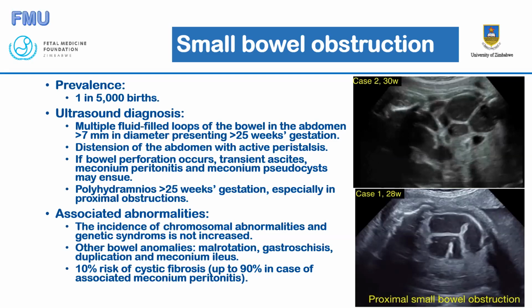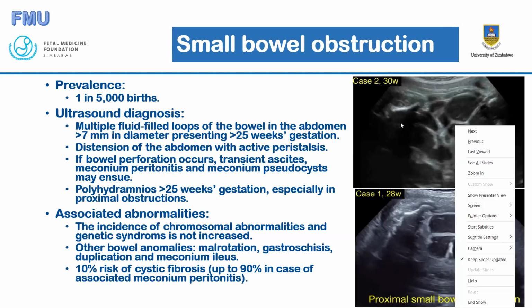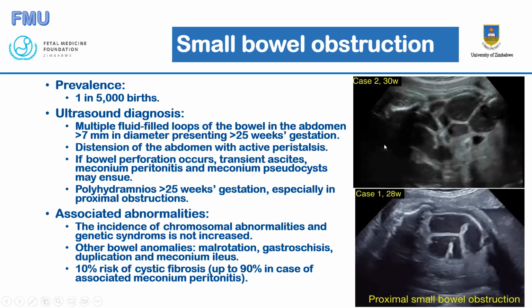So, you distinguish the bowel obstruction from other cystic issues, because sometimes if you are not aware, you could get a similar picture like this one in cases of multicystic kidney disease. You will see how the MCKD looks. It looks almost like the picture on your right at the top there of bowel, but you distinguish bowel from the multicystic dysplastic kidney disease because of peristalsis. Normally, there is actually peristalsis when you continue to look at the bowel.